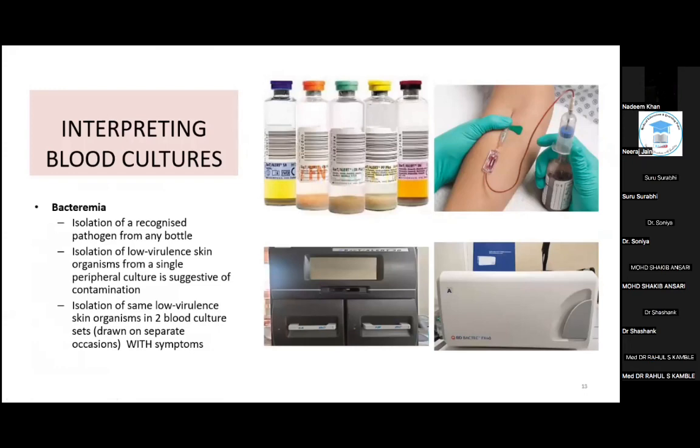The most important test is blood culture. It is imperative to understand that not all organisms are strictly aerobes, nor are all organisms strictly anaerobes. A large number of pathogens, say 80 to 90%, are facultative anaerobes, like Staphylococcus, Streptococcus, E. coli, Klebsiella. So when we set up a blood culture, it is necessary to do both aerobic as well as anaerobic. In fact, from my observation, anaerobic bottles flag earlier than the aerobic bottles.